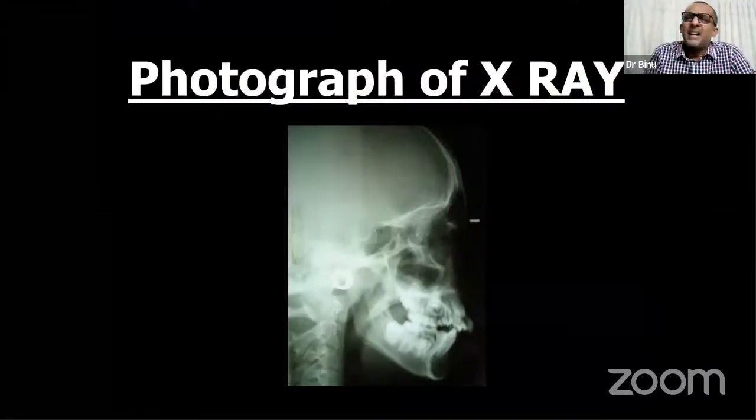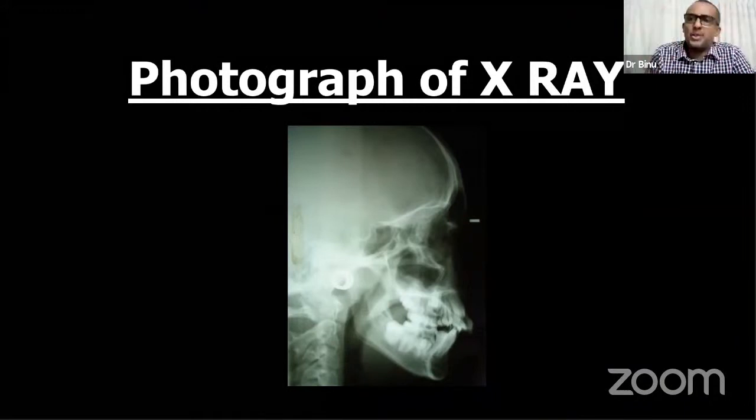Photograph an X-ray. Oh, come on. I think I should take this slide off my lecture because it's all digital these days. But still, I can see some X-ray centers giving films like that. If it's a film like that, all you have to do is put it in a view box. I don't have a view box. Only my orthopedic surgeon, I've seen a view box. I have never seen a view box. Amazon again, 1,300 rupees, you get a beautiful LED view box. Invest in it and keep the X-ray on the view box.